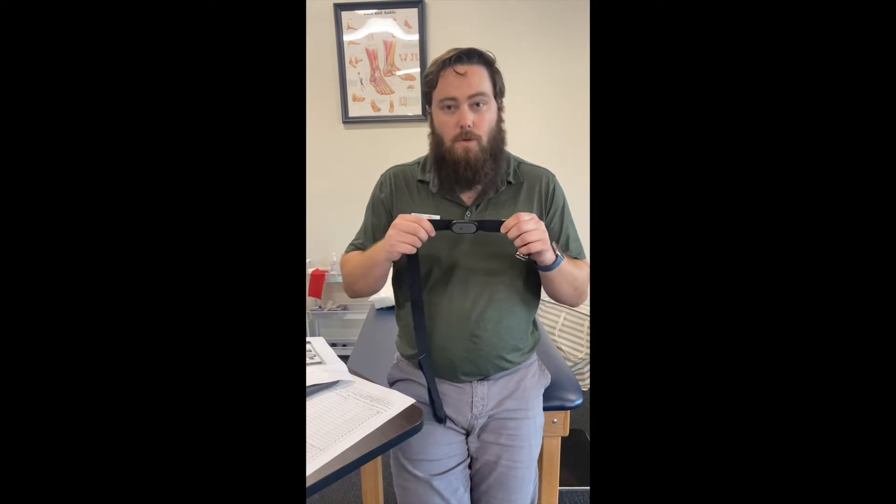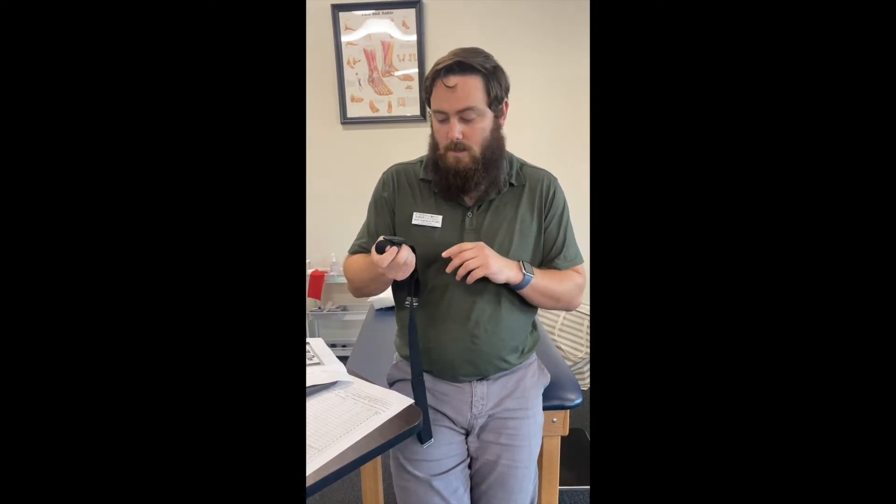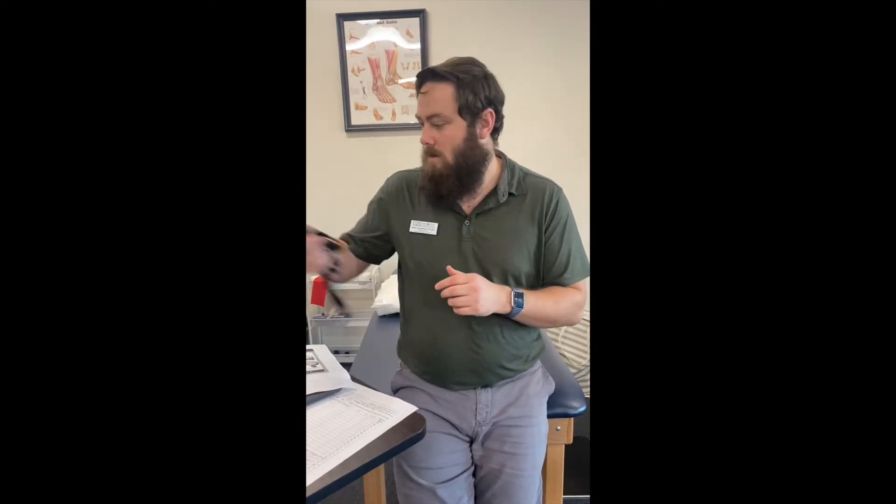After explaining the test, you'll want to give them an accurate heart rate monitor. I like the Polar Series — this one keeps heart rate in real time, it's easy to use and you don't have to wait for it to load to get the heart rate. After they properly put it on, you'll want to let them sit and rest calmly in a quiet area for two minutes to allow you to get baseline heart rate readings.